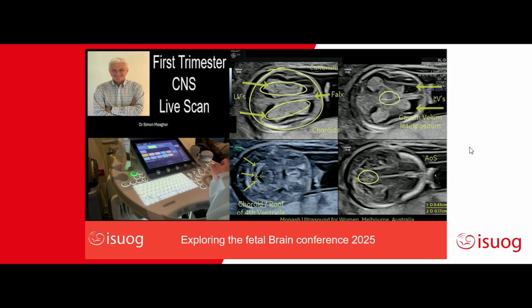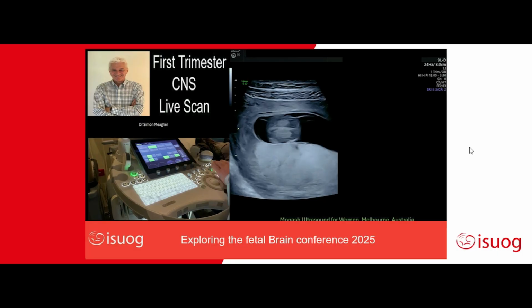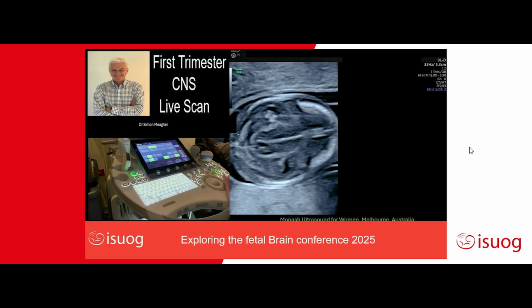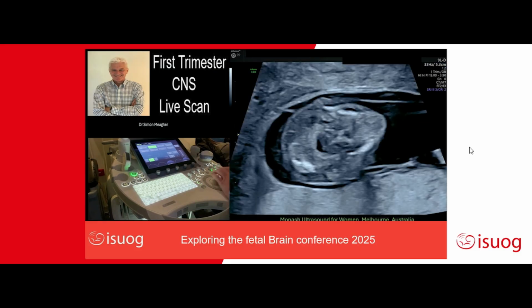And then if you want to, you can split your image at the very end into two, because the two most important measurements that you're going to take here are the measurement of the aqueduct to the occipital bone, which is the most important, and then the next important measurement, which is the fourth ventricle.